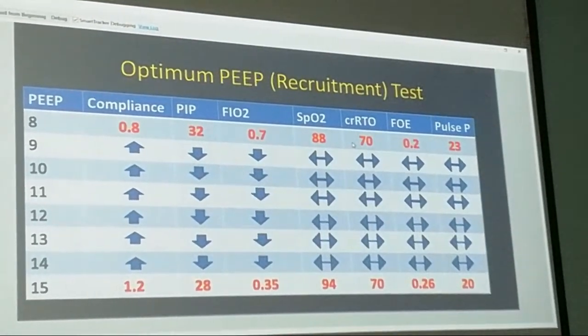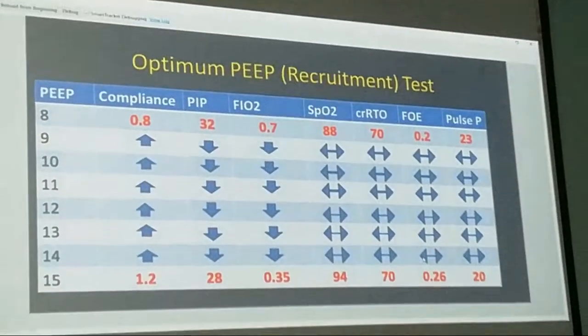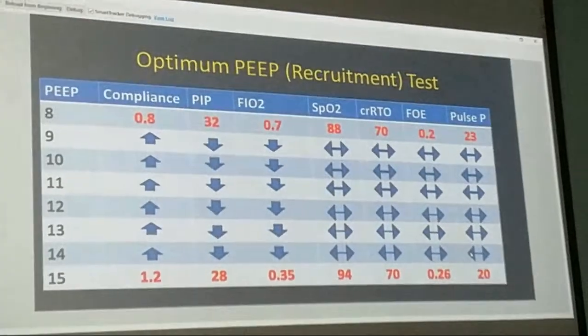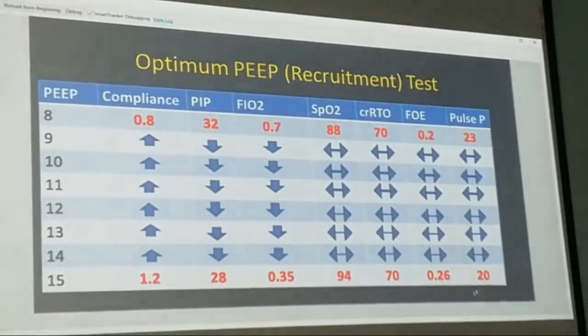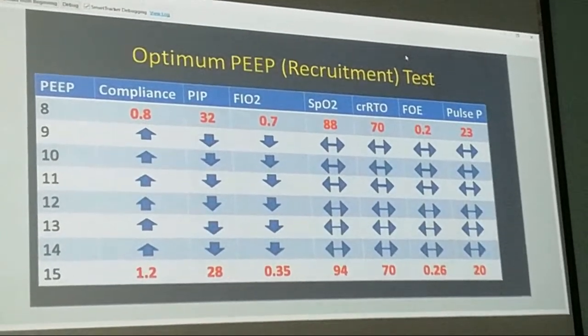Cerebral oxygen saturation did not change, although the fractional oxygen extraction improved. Pulse pressure, which is a reliable marker of compromised cardiovascular dynamics in case of overinflation of the lung, was maintained within the normal range.